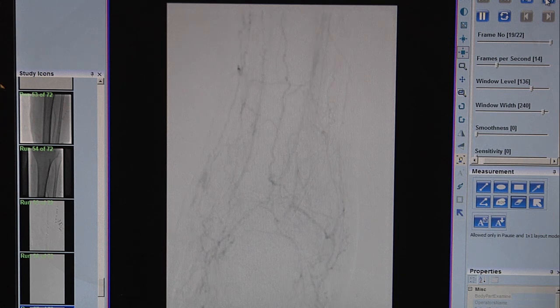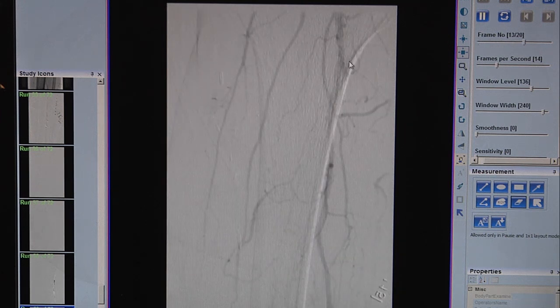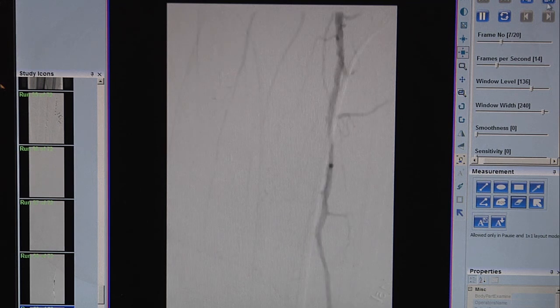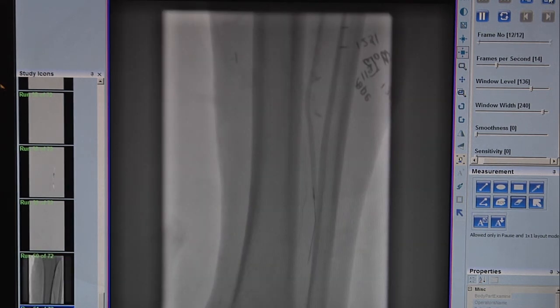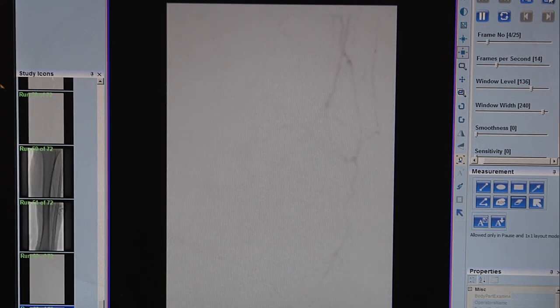I guess we didn't cine it. We did a directional atherectomy of the peroneal. There it is. Directional atherectomy of the peroneal, ending up in wonderful straight line flow through the Zion stent, through the proximal occlusion, through the occluded peroneal segment. Again, we post-dilated with a 3.0 by 35 balloon, and then you can see the fantastic runoff into the foot, straight line flow, and you can see the ulcerated spot in this area.